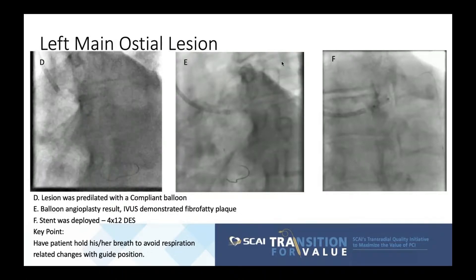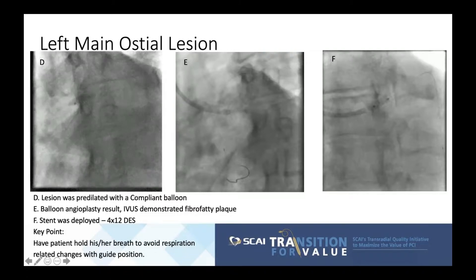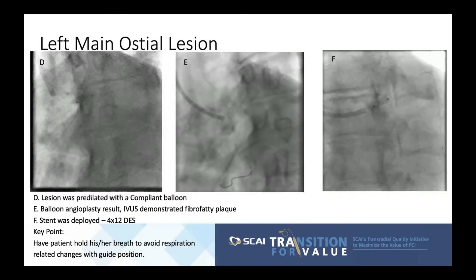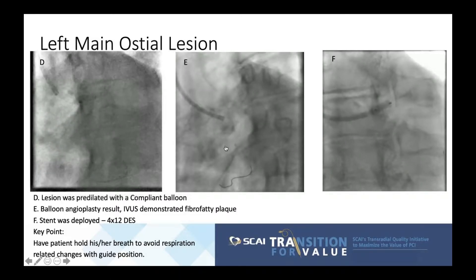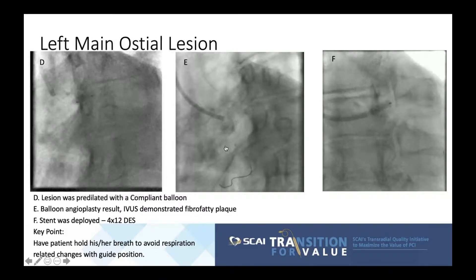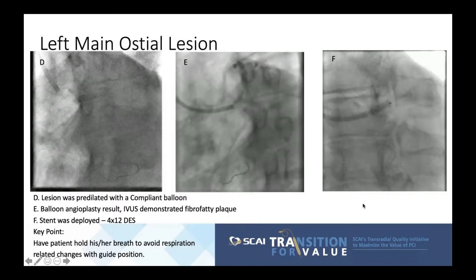The lesion was quickly pre-dilated with a compliant balloon, followed by balloon angioplasty with excellent results. Intravascular ultrasound demonstrated fibro-fatty plaque, and a 4.0 by 12 drug-eluting stent was deployed. A key point during stent deployment: have the patient hold their breath to avoid respiration-induced positional changes of the guide. There have been cases where the entire stent was deployed outside the vessel because the patient took a deep inspiration. Avoid excessive sedation so the patient can follow commands during this critical step.